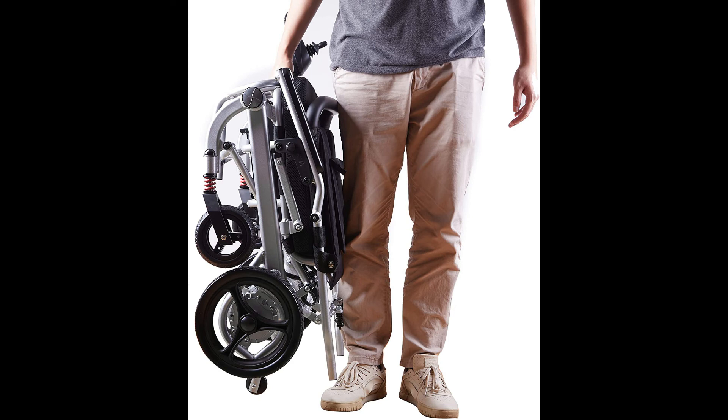It is equipped with hydraulic anti-tilt support. The seat cushion and backrest cover are made of air breeze material — comfortable and detachable for washing.